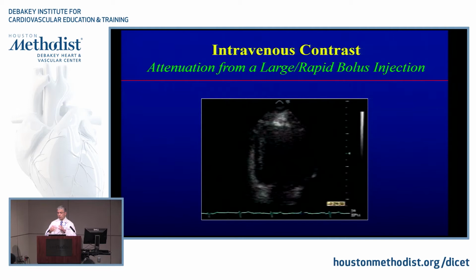And you usually inject it slowly, maybe a cc at a time, depending on what the situation is. And then obviously see what the heart is looking like. Is it too much or is it too little? And then titrate it and top it off gradually over time.